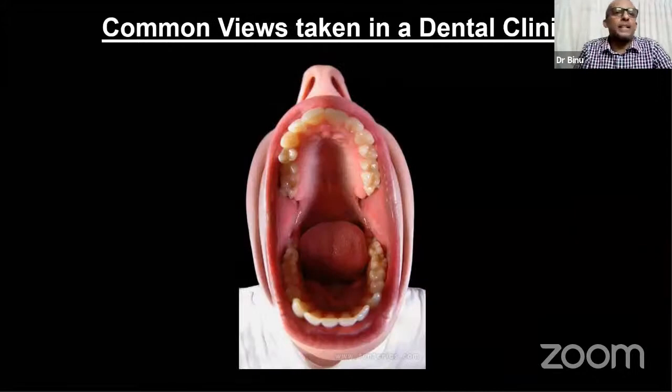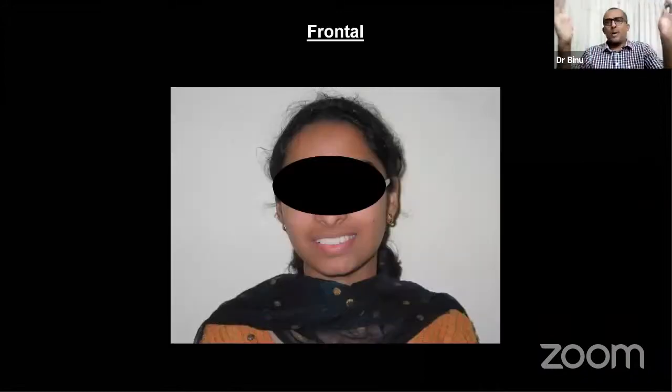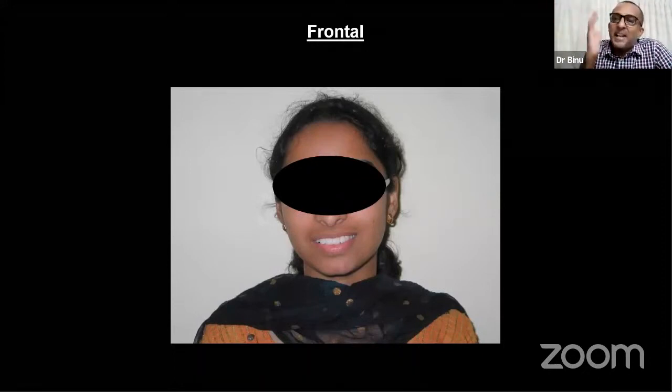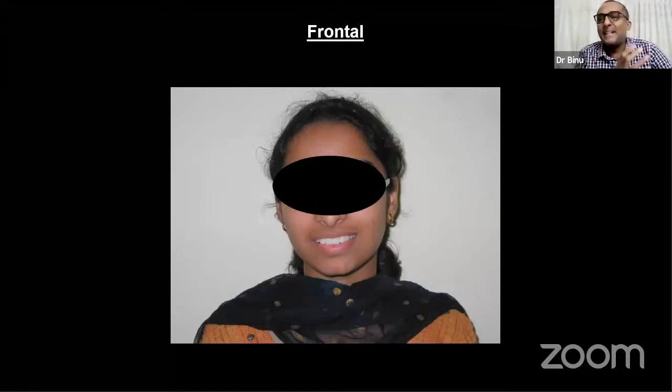Which are the most commonly taken views in a dental clinic? Extraoral view. Extraoral view means outside. Come on, you guys know how to take great extraoral pictures. I've seen so many candidates in their status, excellent pictures, but when they post a patient picture, lousy picture. That is attitude, guys. It's not that you don't know how to take a picture. That's attitude.